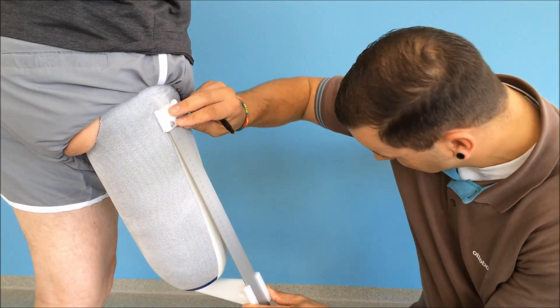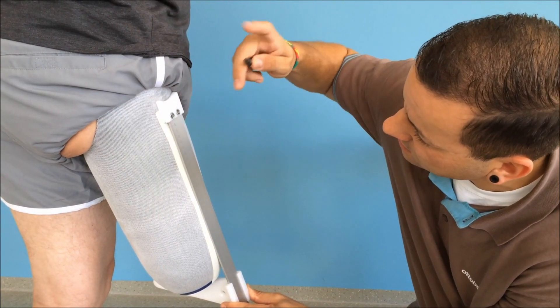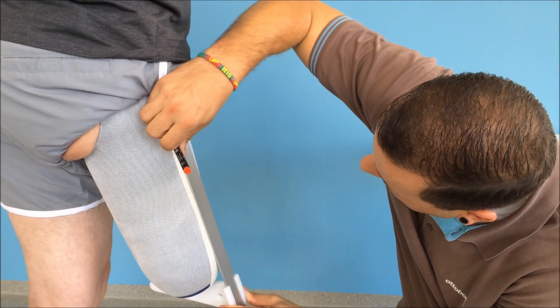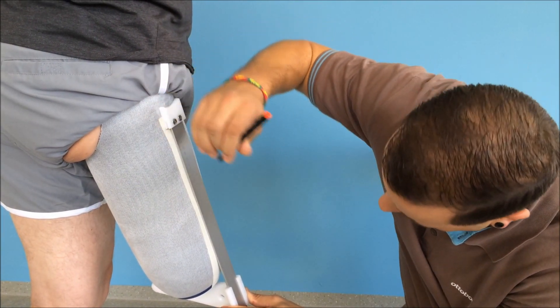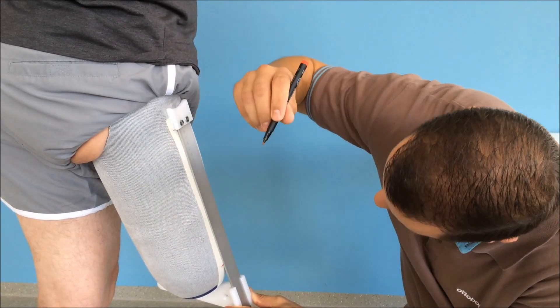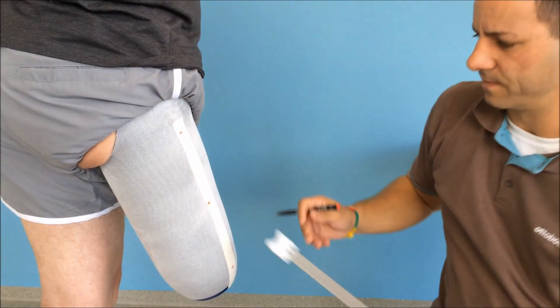For liner fittings we mark the height of the circumference measurement on a bit of adhesive tape. As the measurements must be very accurate, we recommend taking them two or three times so you obtain a precise value.